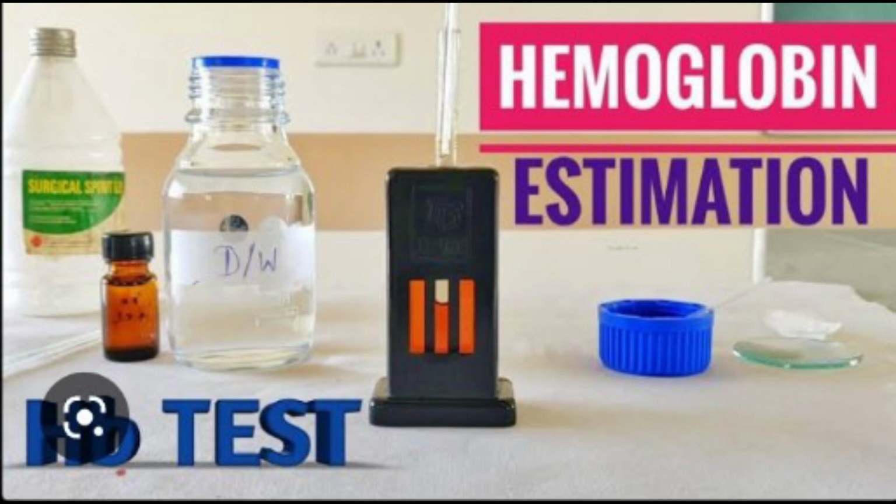Procedure: fill the Hb cylinder up to the lower mark with 0.1 normal HCl solution. Add 20 microliter, 0.02 ml, of blood with the help of a Sahli pipette. Make sure that there is no air bubble inside the pipette. Mix the blood with the HCl already placed in the cylinder. Take care that there is no blood left on the side of the cylinder. Rinse the pipette twice in the blood solution. Allow it to react for about 10 minutes till the solution becomes dark brown in color.